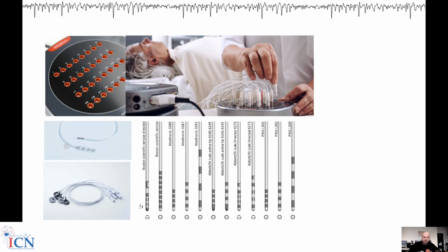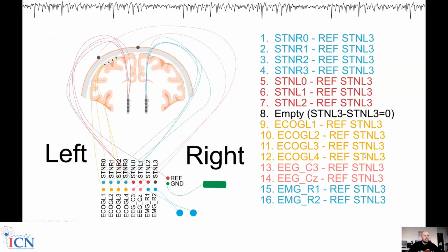So Andy, can you tell us, is it going to be an 8 contact or 16 contact electrode? 8 contact as well. I thought 16, but it's the same thing. It's very similar except for the marker to the normal Boston, and it also has 3 mm spacing and 2 mm. So 2 different versions. So it's basically the Abbott electrode. Yeah. Okay. So let's move on.